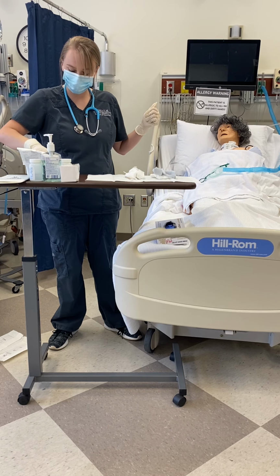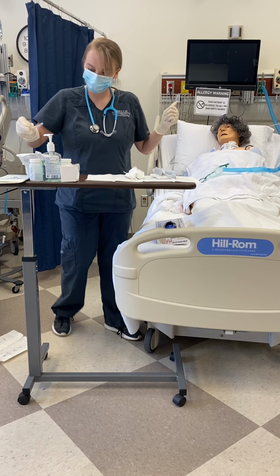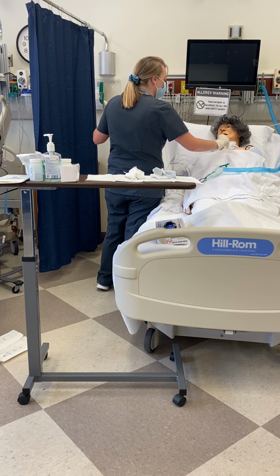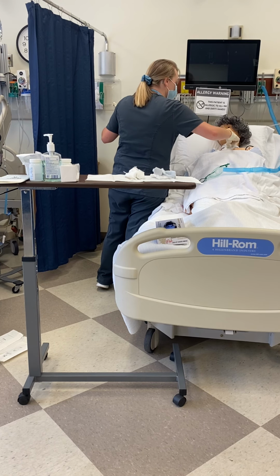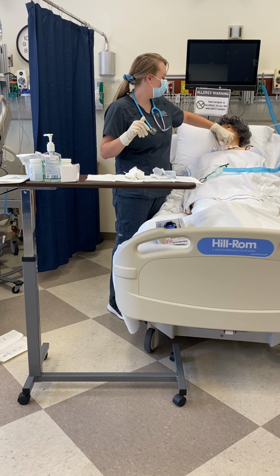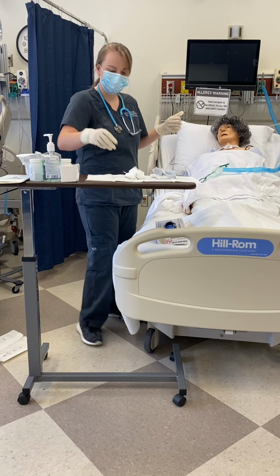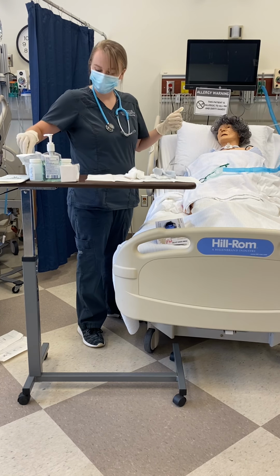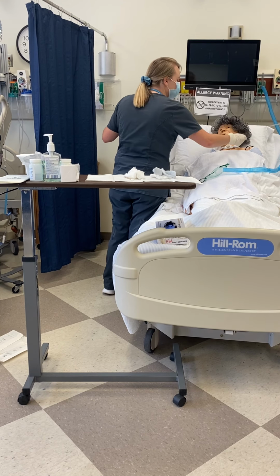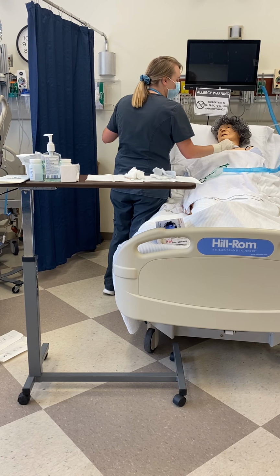And then once that's rinsed off, I will put this back in. Make sure you hear the click. Alright, and then with my dirty hand, I'm going to take this out. And I'm just going to clean around, assessing the skin underneath for any pressure wounds or any skin breakdown.